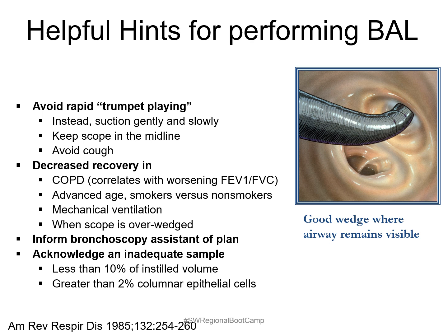It's also useful to know that you can generally expect a lower rate of return in patients with COPD, advanced age, smoking history, or on mechanical ventilation. Overwedging the scope will also result in a lower amount of return.